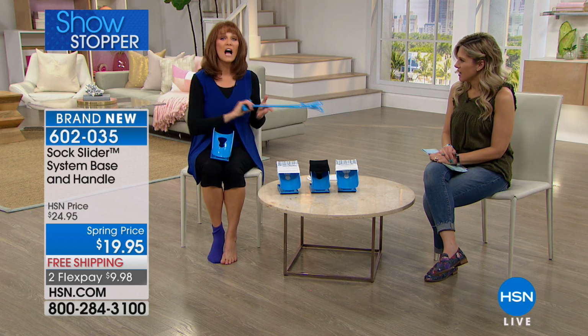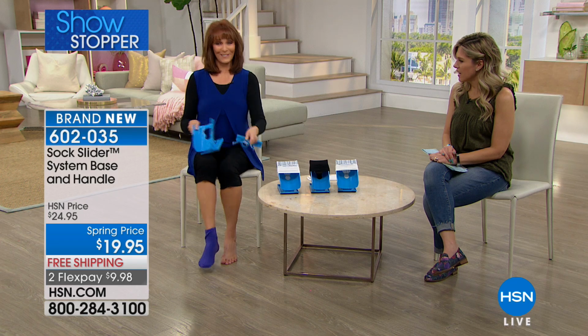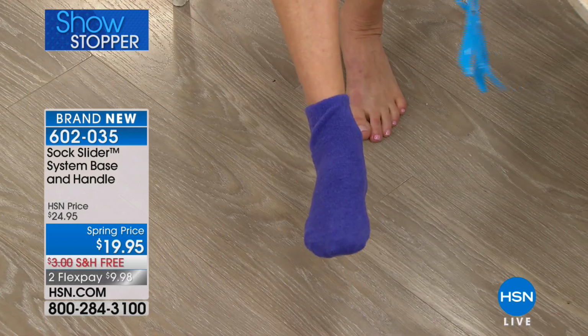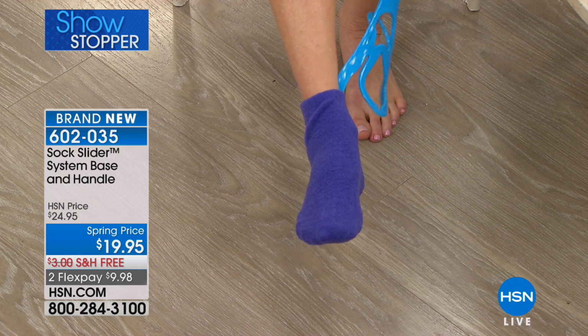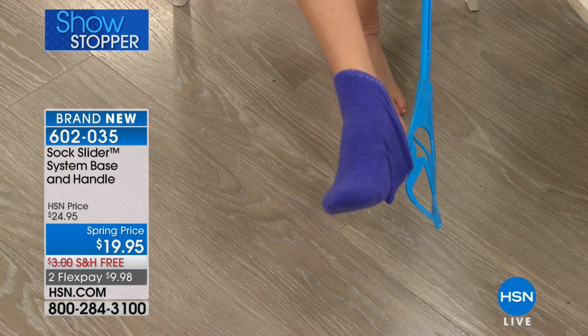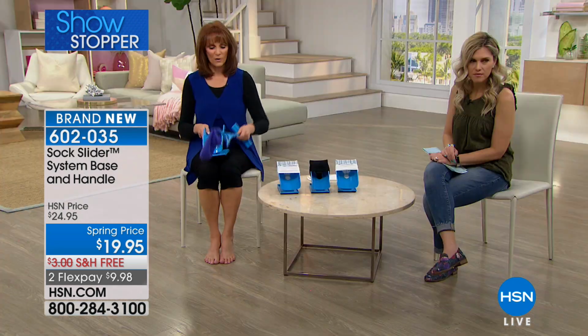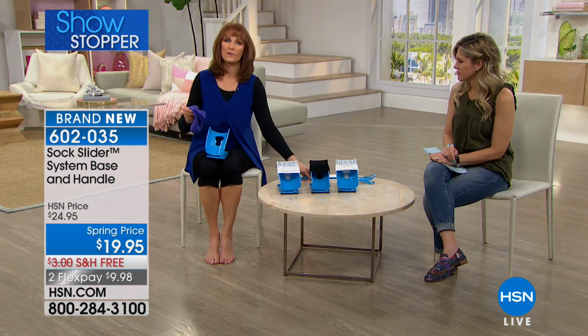So let me put a sock on for you. Oh, here, I'll take this off with this. So you can actually take it off with the aid as well. It's nighttime now. You saw me put it on, now I'm going to take it off. It has a little hook. This is a multi-tool, so I can take off that sock again without me bending over. Now I'm going to bring it up to me and show you how to put on the sock.